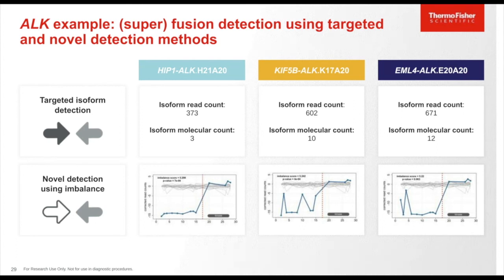This is based on an algorithm where the imbalance and the p-values are calculated for each key driver gene and then reported as present or absent based on the threshold set. This approach also utilizes a baseline for more robust calling of the exon tiling imbalance.